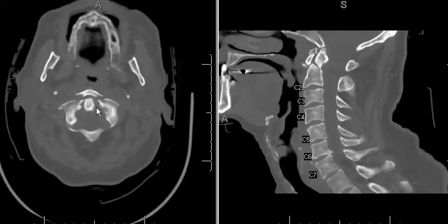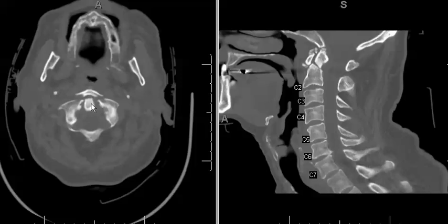It is also important to assess stability of the transverse ligament, which can be evaluated by measuring the displacement between the lateral masses of C1 and the lateral aspect of C2. If that distance is greater than seven millimeters, that represents injury to the transverse ligament. In this case there was no such injury, and no distance greater than seven millimeters was seen — this distance measured approximately four or five millimeters.